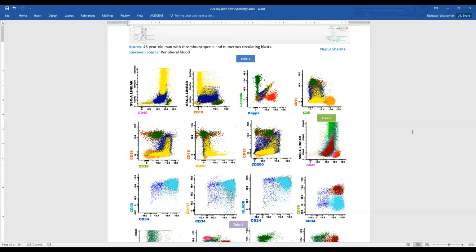And also the morphology of the blasts helps because they would be more of, you know, the M2 or M3 blasts. There will be granules, they will have those salmon colored granules, and they will have the sunset sign. All those things will help. But you need your FISH and cytogenetic studies, or sometimes even PCR, to classify this accurately as AML with 8;21.